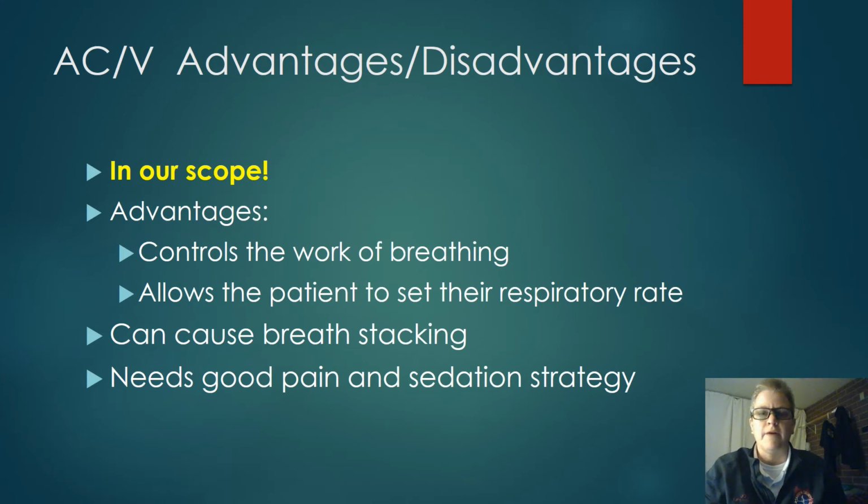Okay, let's talk about advantages. I just did talk about some disadvantages, but number one advantage, it's in our scope. We can use it. Yay! It helps control the work of breathing so that their muscles in their body can recover from that fatigue that they've had. It does allow the patient, if they overbreathe that ventilator, to set their own respiratory rate.